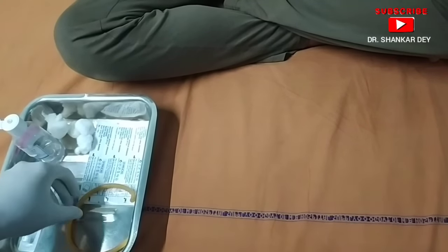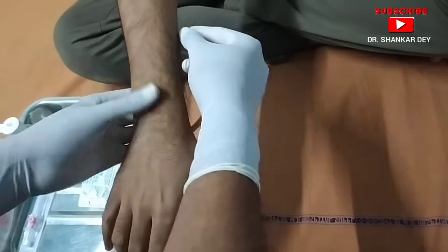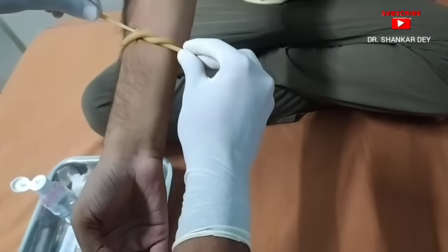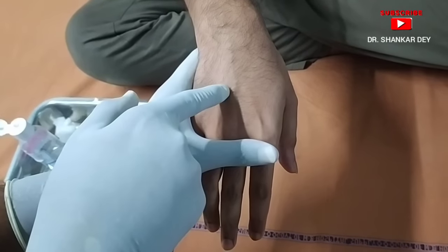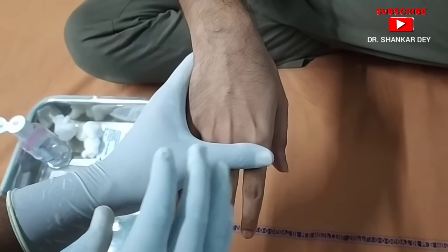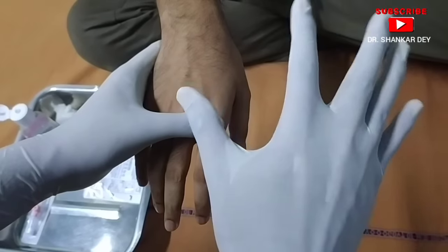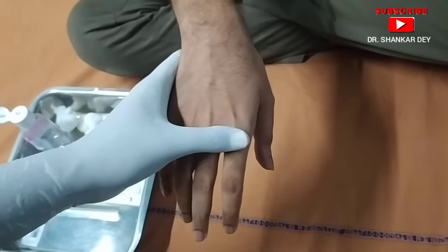The second step is to take the tourniquet and tie it just above the site where you are going to insert the cannula, like this. Next, as you can see, there is one visible vein. If the vein is not properly visible, you can ask the patient to open and close their hand a few times to make the vein more prominent.